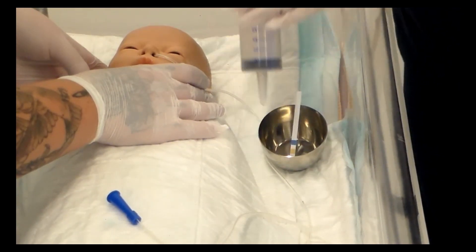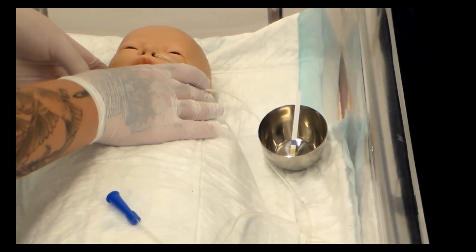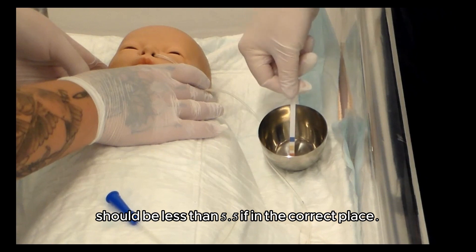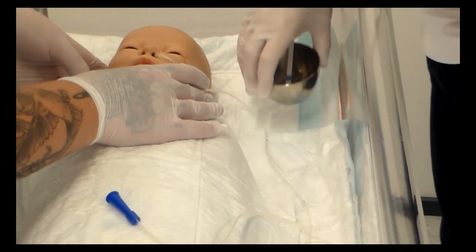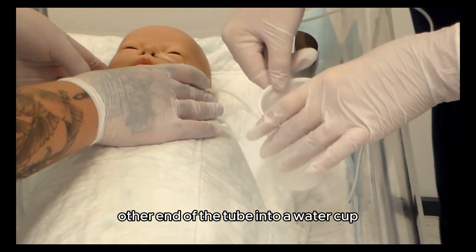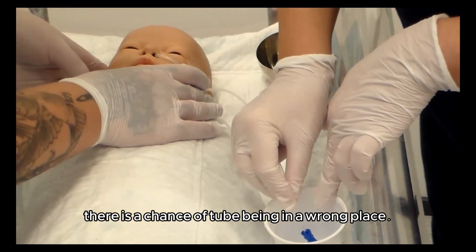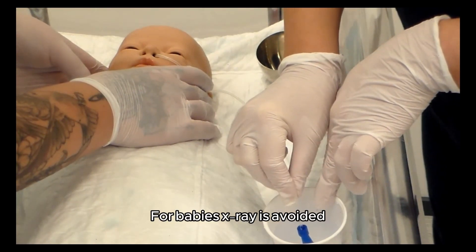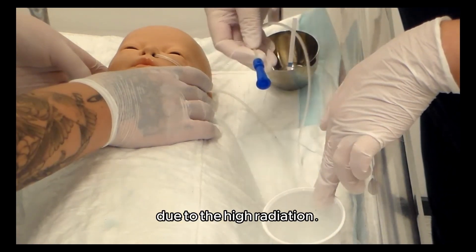The methods used are: take a syringe and draw stomach content into it, then put a few drops on the pH indication strip. The pH should be less than 5.5 if the tube is in the correct place. Another way to check correct placement is to dip the other end of the tube into a water cup to see if any air bubbles appear — if so, there is a chance the tube is in the wrong place. For babies, x-ray is avoided and used only as a last resort due to the high radiation.